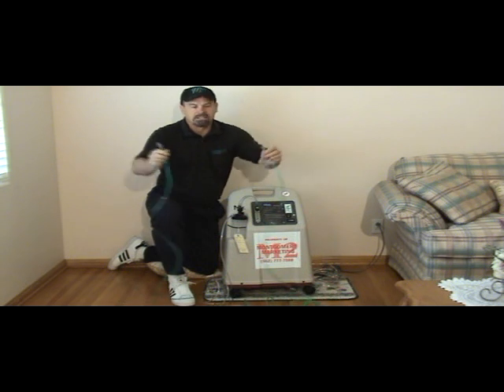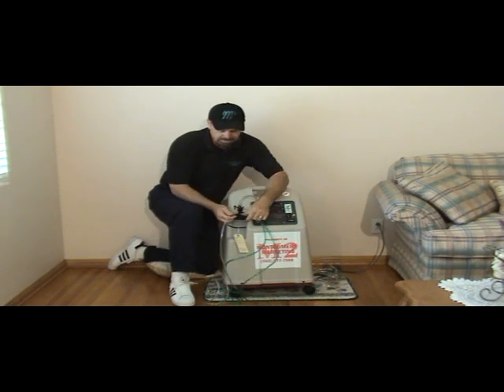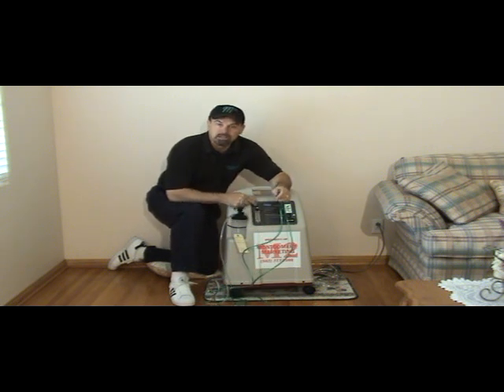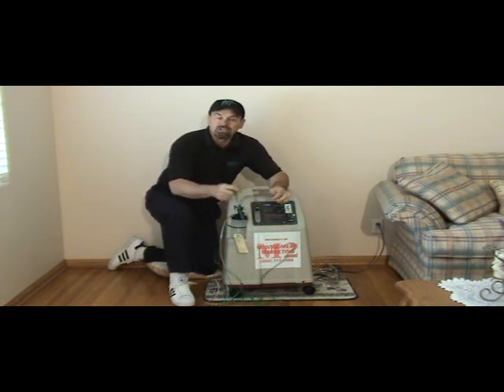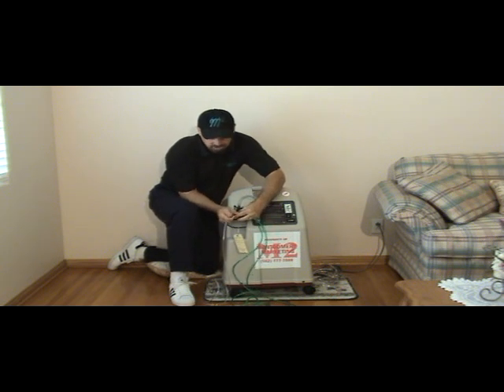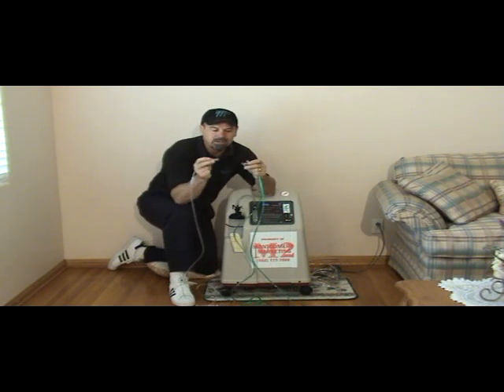With the extended tubing, you have 2 ends that look just like the one that connects either to the bottle or to the concentrator. So if you're going to hook this up to allow the patient to move around, the first thing you need to do is disconnect the nasal cannula again, or the mask, and then you have to have a way that you can connect these two together.